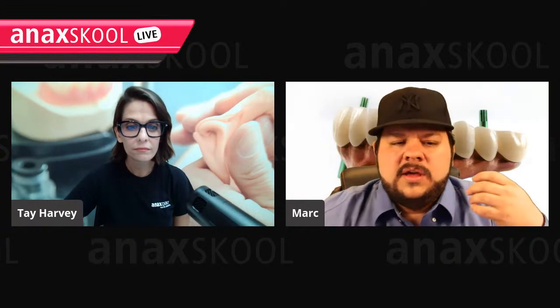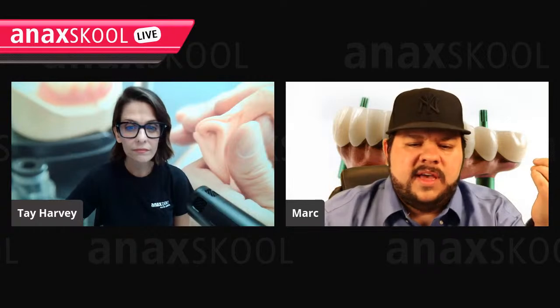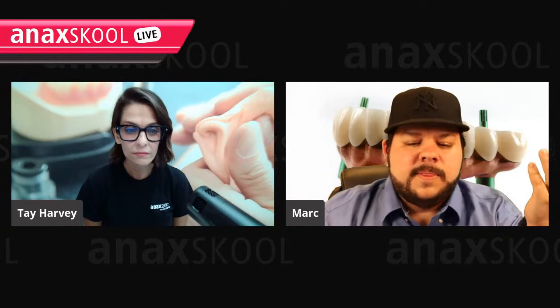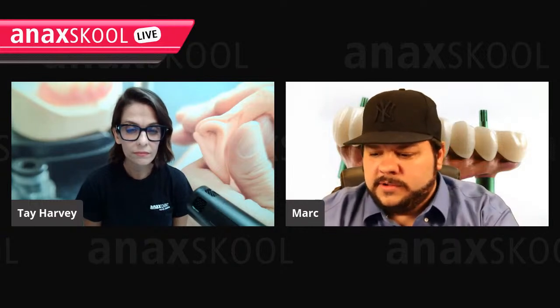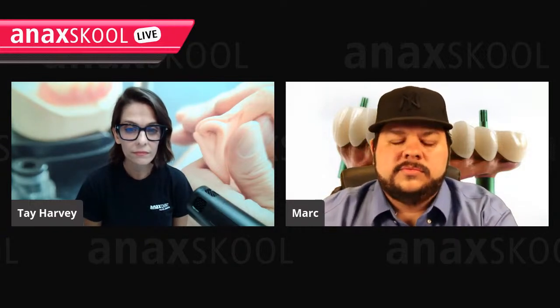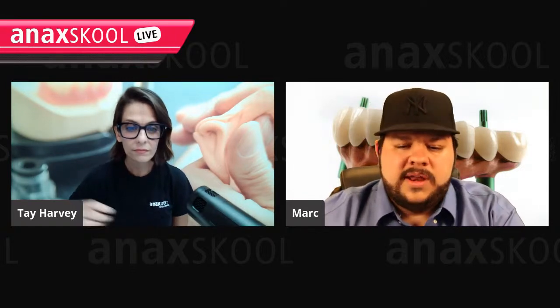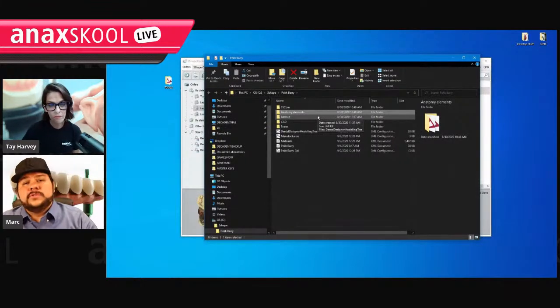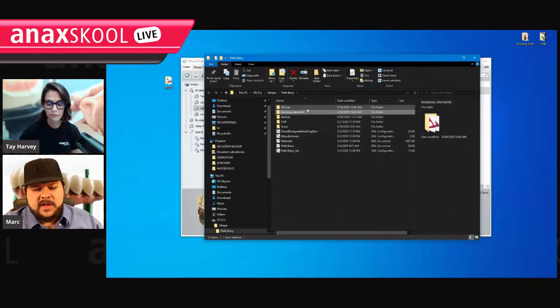But real quick, one thing people don't know is when you build a case and you're finished designing, some things within the directory get updated. So this is very basic: go to your Windows directory, explore the order, and in here you have anatomy elements. That's your design after you close. As soon as you close the order and it saves, those anatomy elements get put in here.